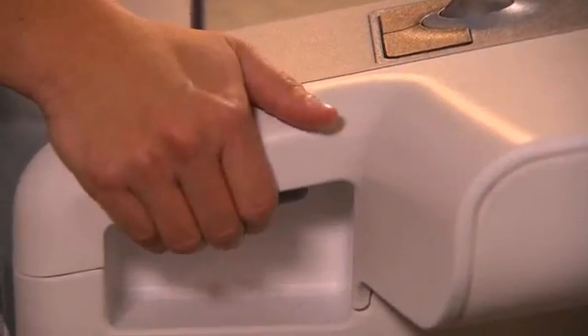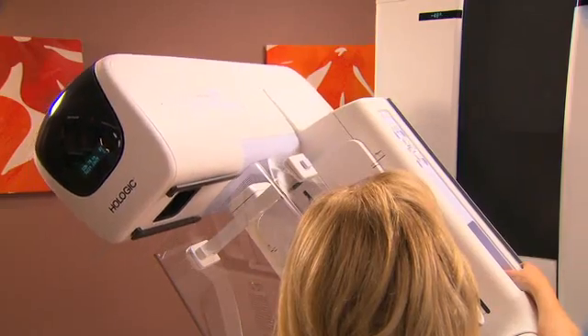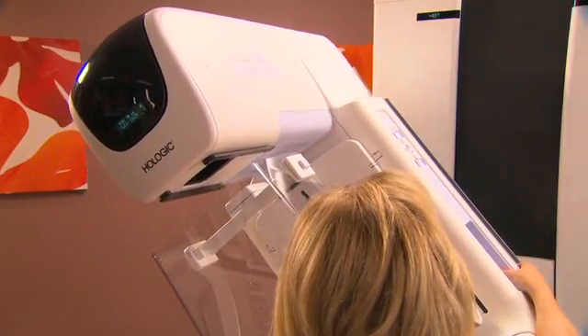To perform tomosynthesis, the imaging arm moves in an arc above the breast, quickly taking a series of very low-dose images.